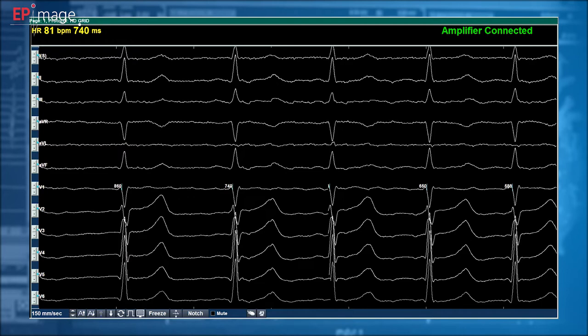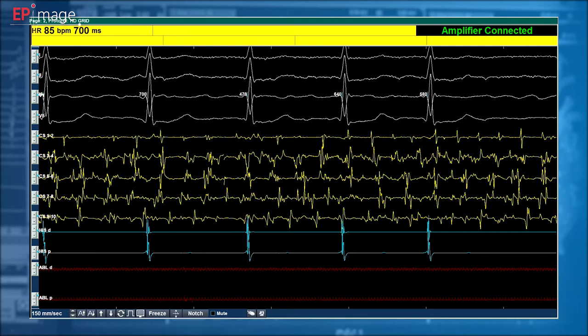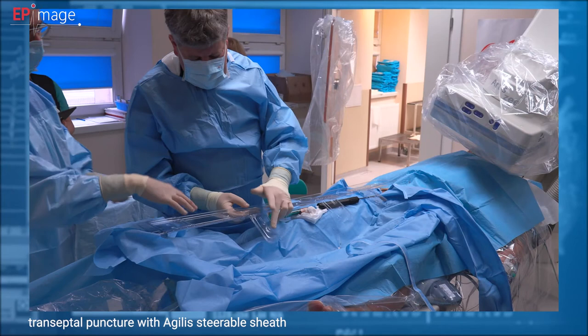So, welcome to EP Lab. We're just starting. As you see, we have a patient with persistent atrial fibrillation, and we still have atrial fibrillation in this patient. What we've done so far, we introduced a decapolar diagnostic catheter into the coronary sinus, and there's an additional diagnostic catheter in right ventricle.